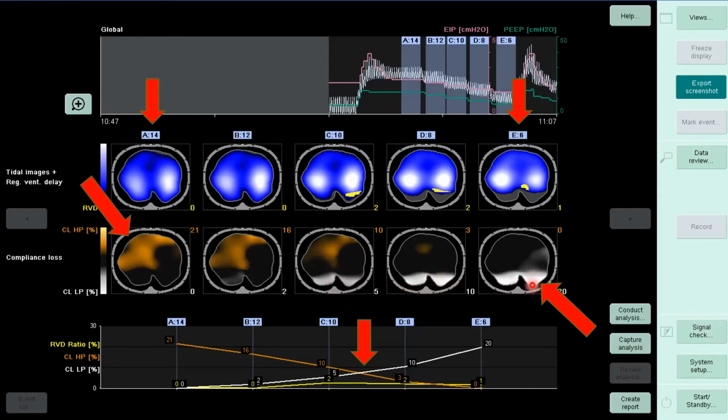So they suggest that over here indicates the least amount of overdistension and the least amount of de-recruitment, but we still have to use our clinical judgment. If you have a morbidly obese patient with pretty safe plateaus, perhaps you're going to go more between 12 and 10, perhaps 11 would be ideal. But in general, a good area is when they both cross, you're getting the least amount of issues.